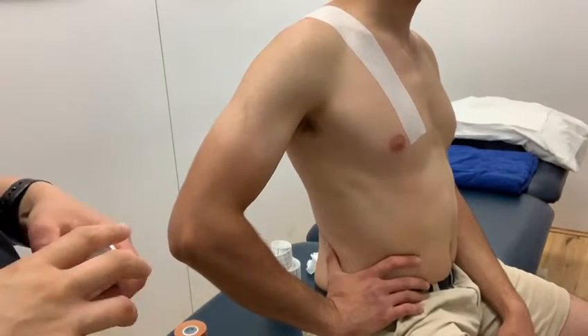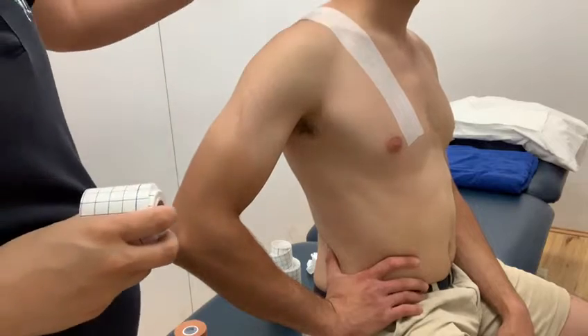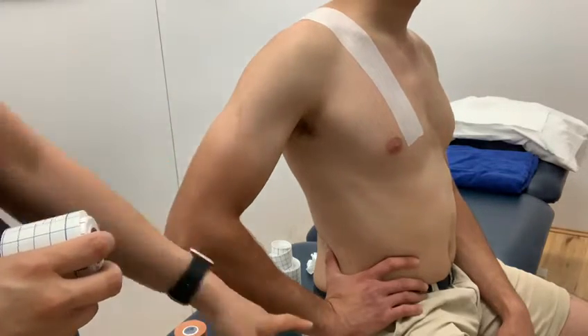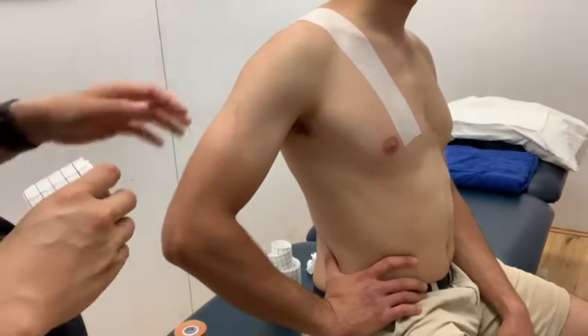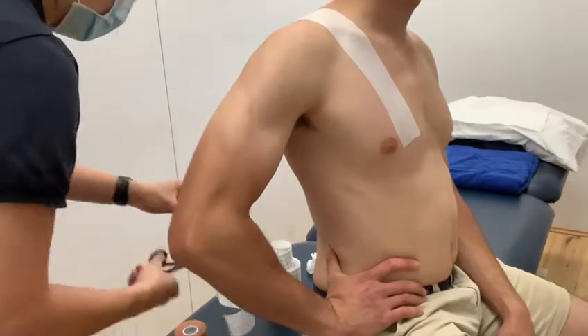We're going to do an AC joint taping. I've already done an underlay for the anchor. It's going to come in just above the nipple, and you want to make sure that the patient has a hand on the hip and the shoulder pulled back. The anchor around here — you want to make sure that they flex their biceps.